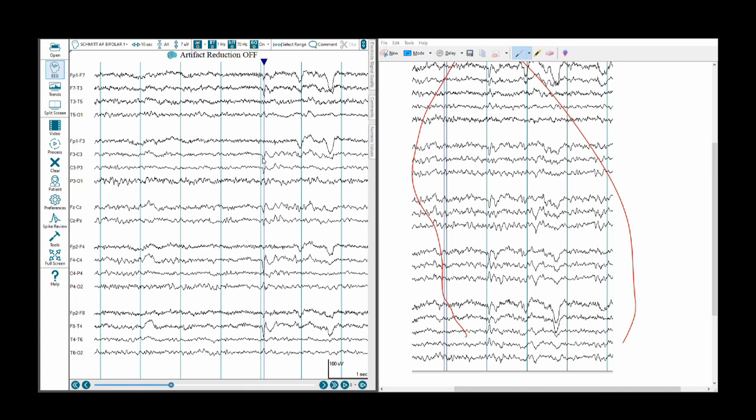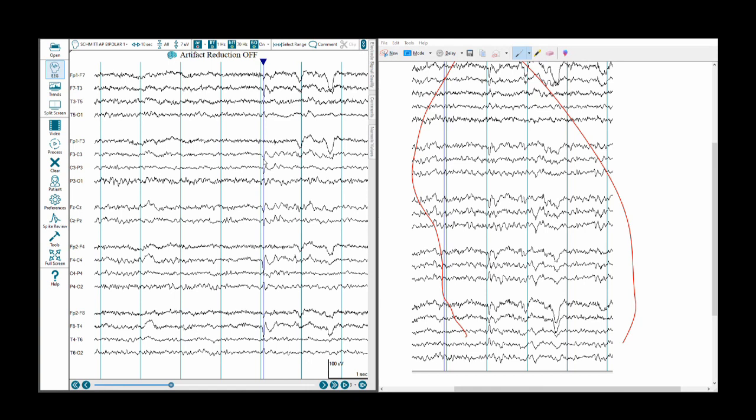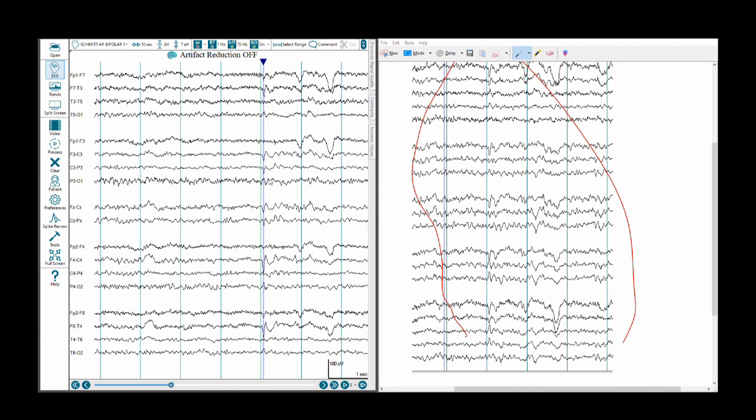It might be picking up propagation from the field arising from the right centrotemporal region. So we have made sense of this first set of electrodes, the left temporal chain. We are going to go with the premise that there is a positive tangential dipole over the frontal region. If that is the case, why is there no deflection at this moment over the FP1, F3 region? That is most likely because they are equally involved. You can even see this positive dipole extending to the C3, P3 channel. But F3 has a downward deflection with respect to C3 because it is recording that positive discharge.